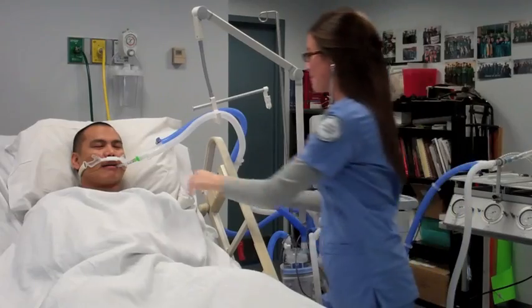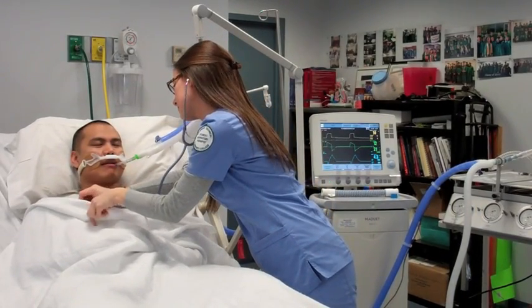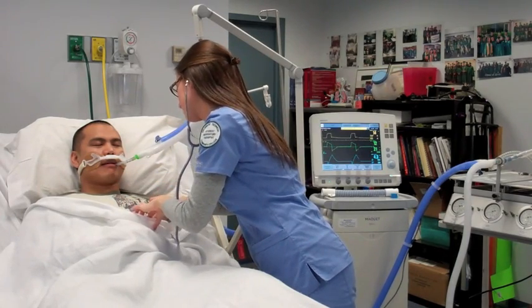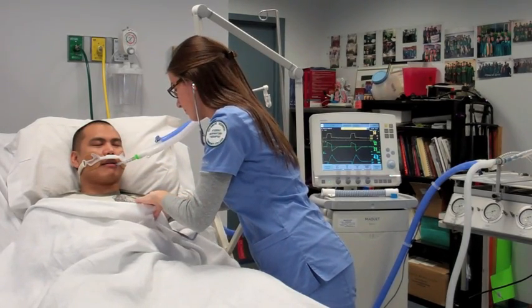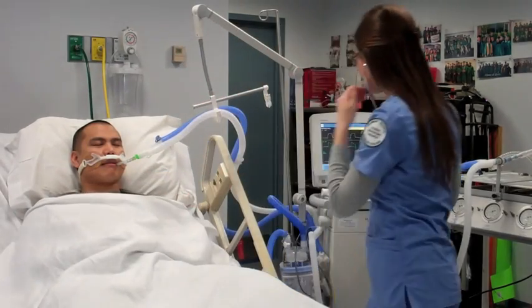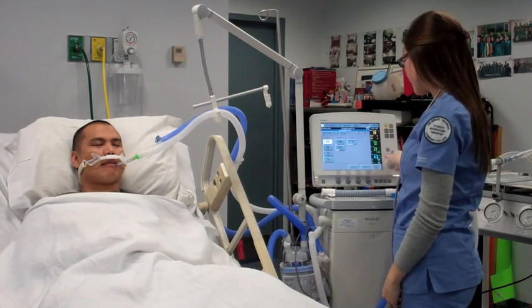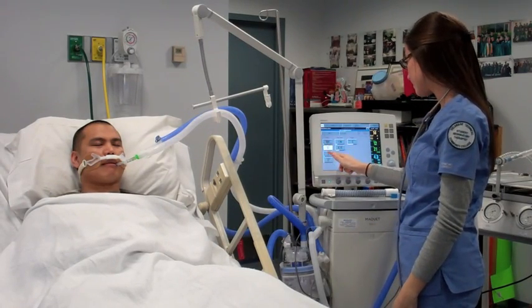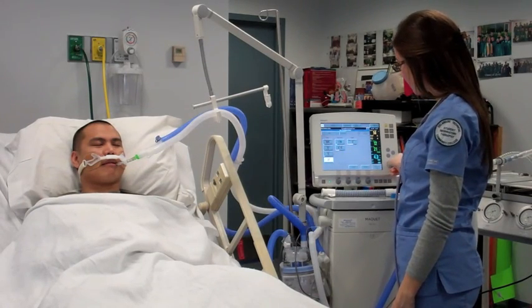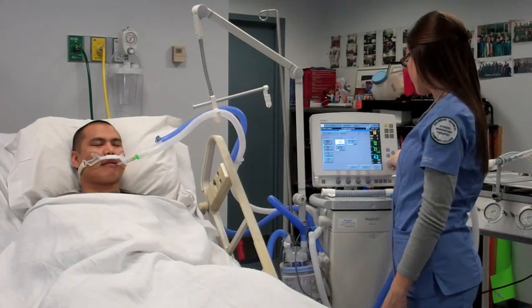Today our patient is Mr. Costillo. He is coming to the cardiac ICU postoperatively from his CABG x3 surgery and his medical history is significant for COPD. Mr. Costillo is already intubated and being mechanically ventilated on the following settings: PRVC, tidal volume of 500, PEEP of 5, FiO2 of 40%, respiratory rate of 12, and an I:E ratio of 1 to 4.